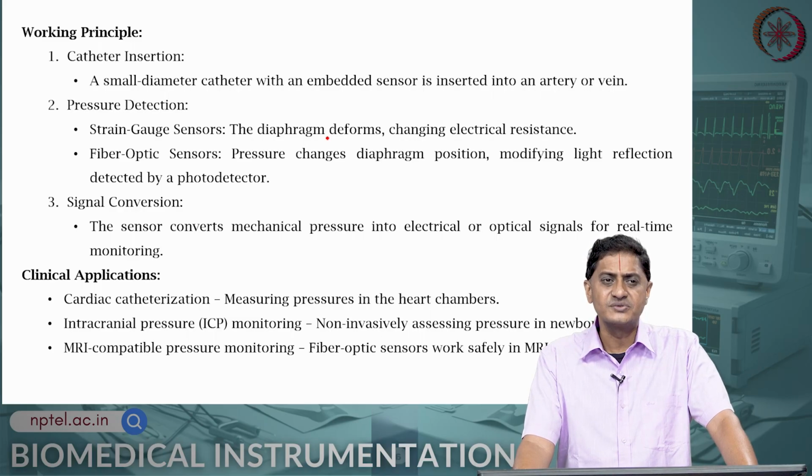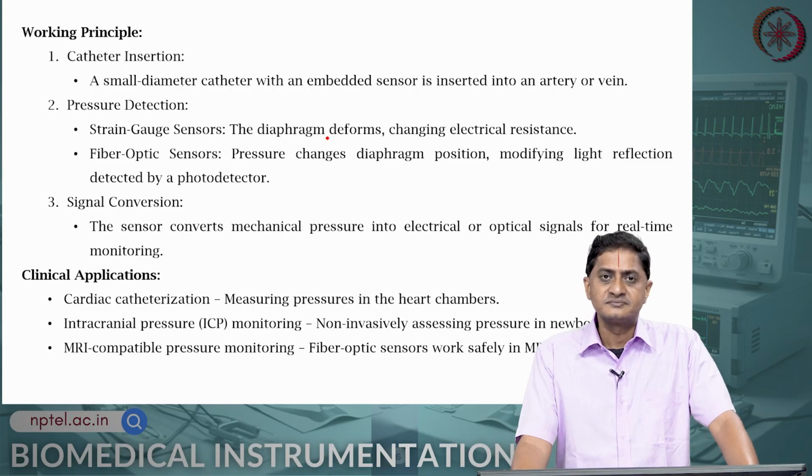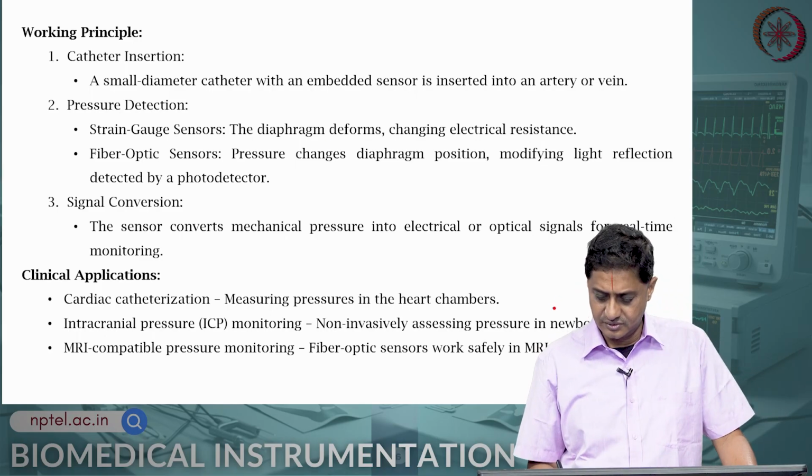The advantage and the applications are in cardiac catheterization, essentially used to measure pressures in the heart chambers. Also, if you are interested in measuring ICP values, intracranial pressure in head trauma or in neonates. Neonate means newborns.